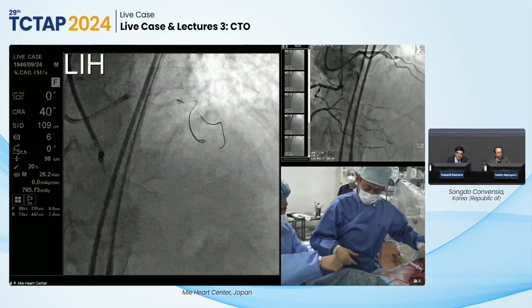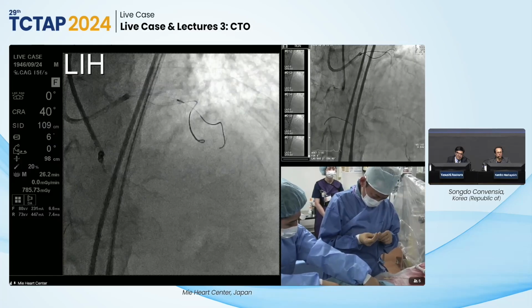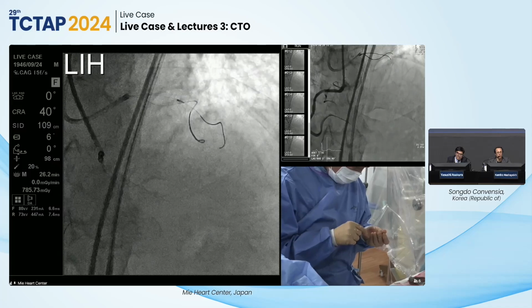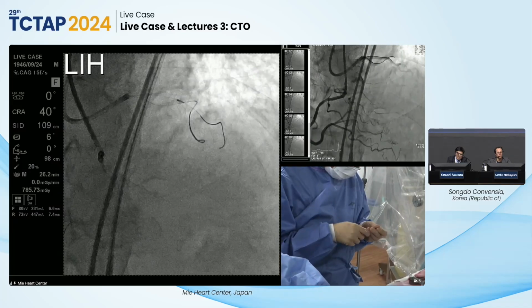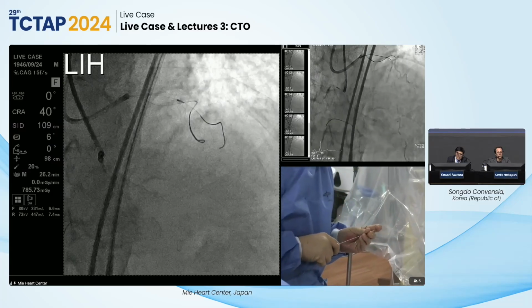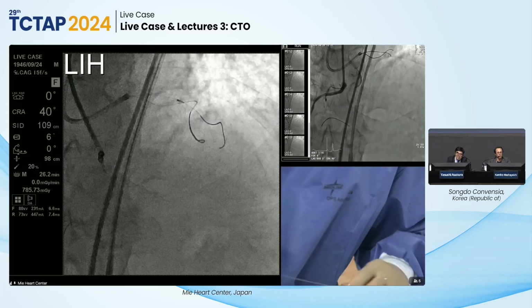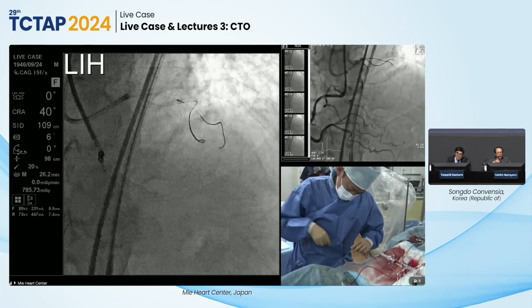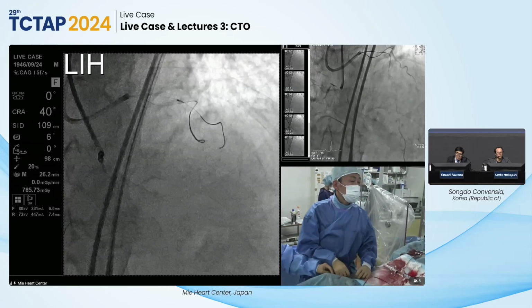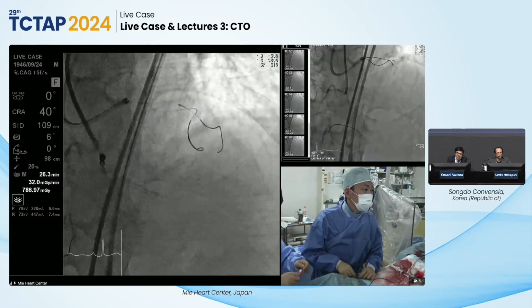Well, I think it's very important to take a little bit of time here for the antegrade cap puncture, to do that properly, because it's really a great solution. Once you have, I think based on the CT scan, a great puncture done antegradely, you might really have a good chance to get an intraplaque position there. And this is why he's really taking his time doing a wire escalation technique, and not only trying to get somewhere in the architecture, he really tries to puncture the cap in an intraplaque position. That's what I think he's doing, and it makes sense to me at the moment.